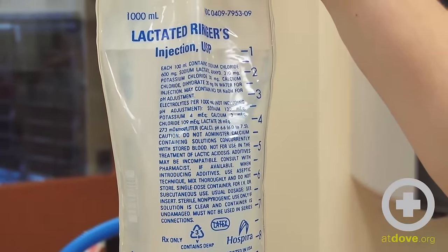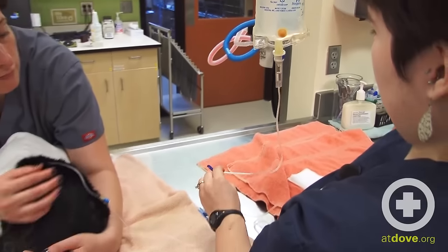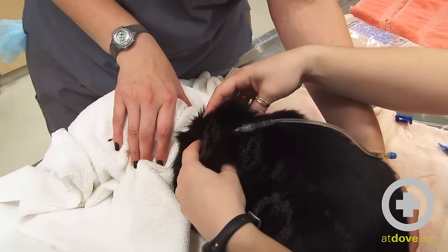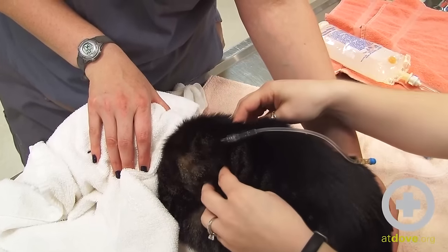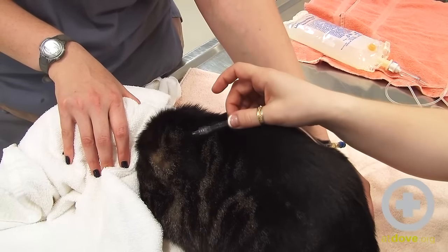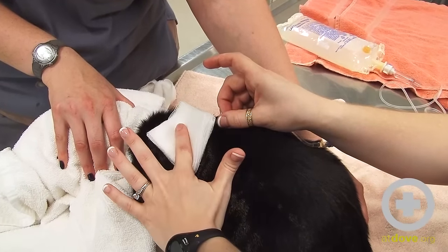It looks like I'm just about at 100 mls, so I'm going to clamp off this line so the fluid stops dripping. You can see a fluid pocket has formed under the skin here — they kind of get a camel hump. That is where the fluids go; it's not painful and it'll just absorb as they need it. I'm going to put gauze over where the needle comes out and just put a tiny bit of pressure while I pull the needle out.